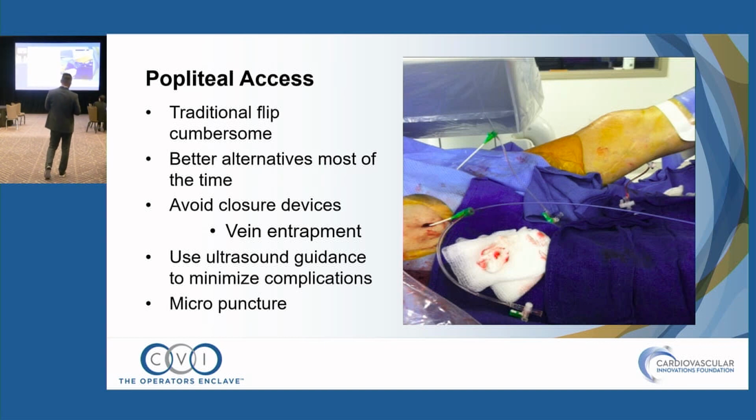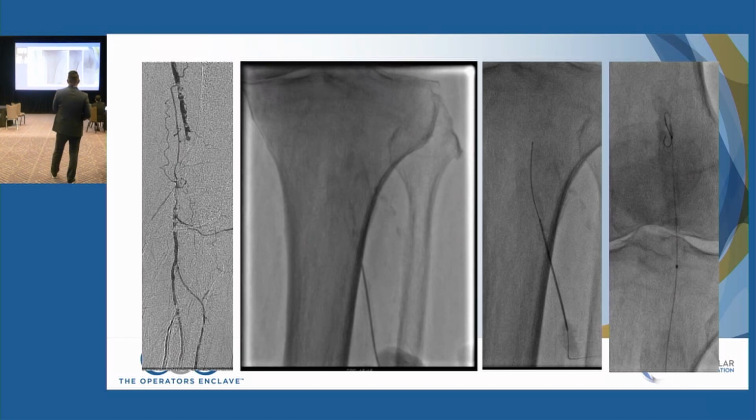But one way to do it is sort of elevate the leg here, put a little crate under the ankle or something, and you can basically take the probe, as long as it's prepped, and just hold it under the knee, and then just watch the screen and avoid the vein and literally do it like this. Once you get access, put a sheath and then just tape it to the front. So that's one way to do it.